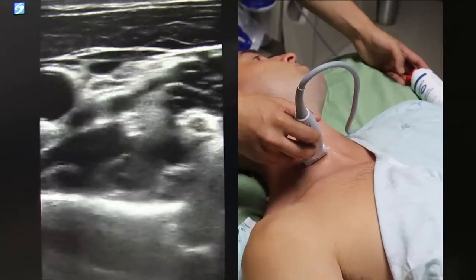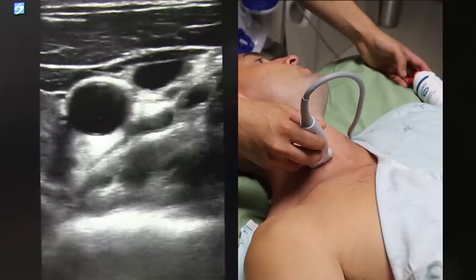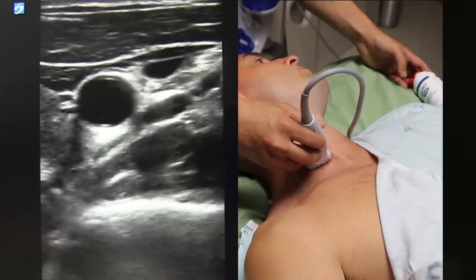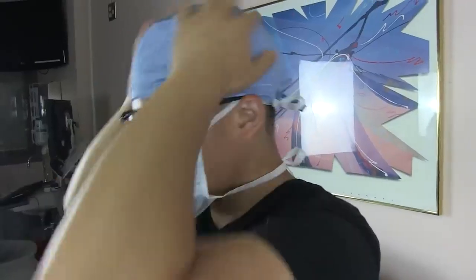And I know this is the internal jugular because it is lateral and superficial to that other vessel, which must be the carotid. You can convince yourself further by doing some compression testing. The vein will compress and the artery will remain plump and pulsatile. Well, with that out of the way, let's grab some PPE and get the supplies we need for the procedure.